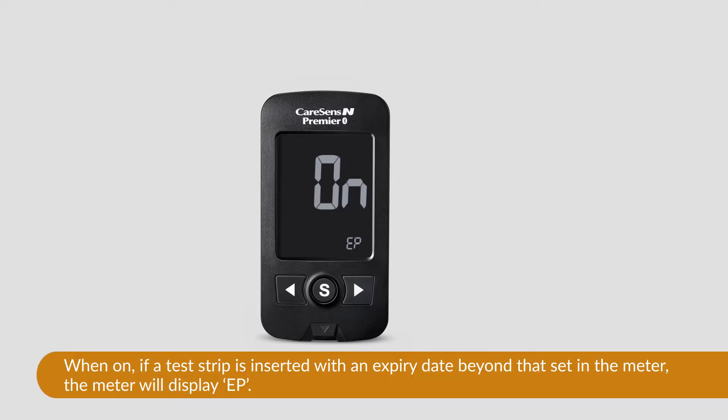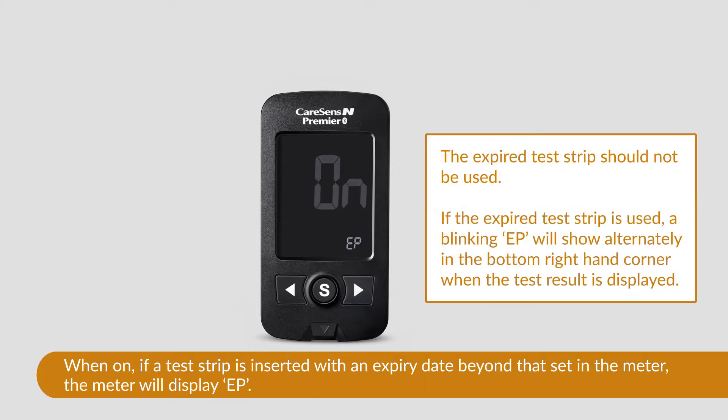When set to on, if a test strip is inserted with an expiry date beyond that set in the meter, the meter will display EP. The expired test strip should not be used. However, if it is, a blinking EP will also show alternately in the bottom right-hand corner when the test result is displayed.